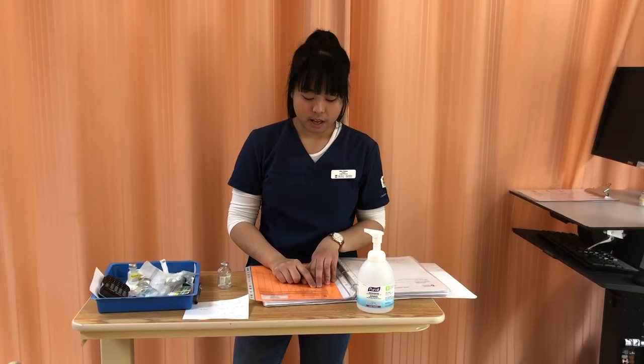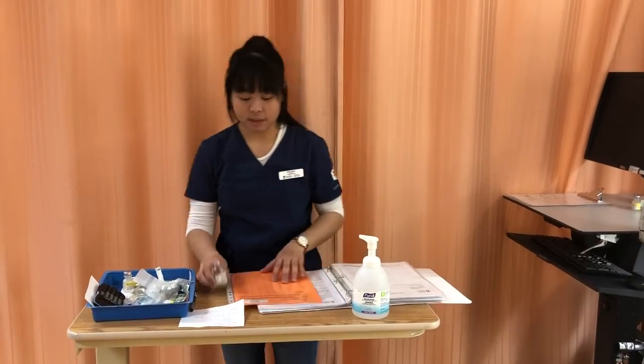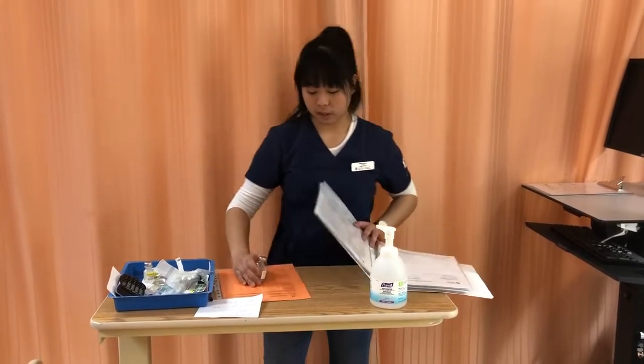So I have IV. It says can be given IV, so that's the right route. And I have every 4 hours, and it's due right now, so that's the right time and frequency. And it's not expired as well, so we're good with that.